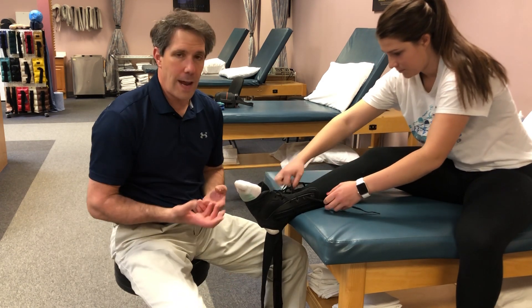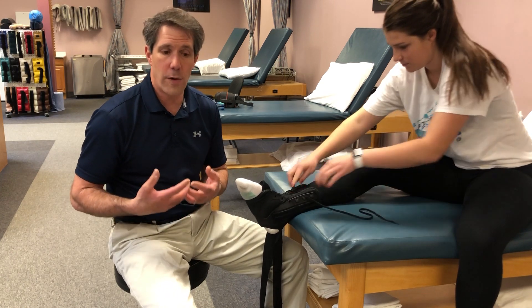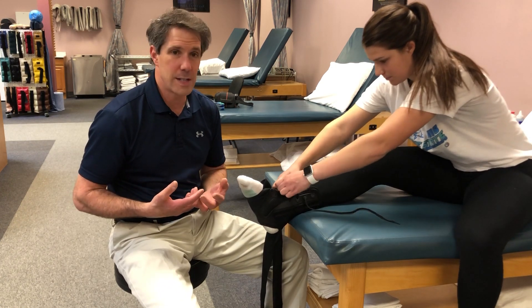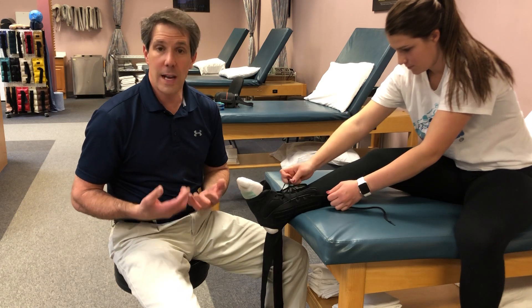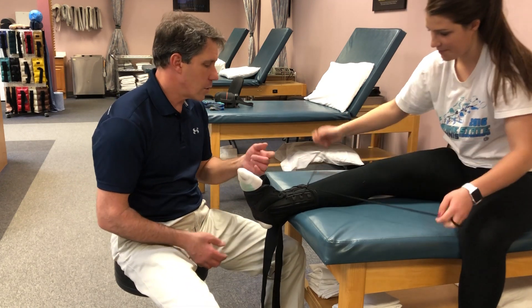We don't use braces for a long time because it's very important that your foot and ankle take a load. It needs to have some stress on it in order to be strong and tolerate the things you do — like walking, standing for a long period of time, or going out for a run.